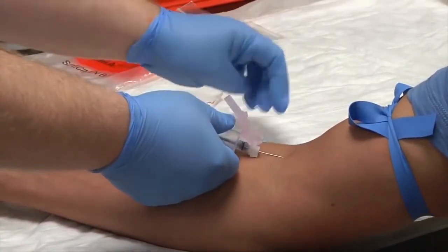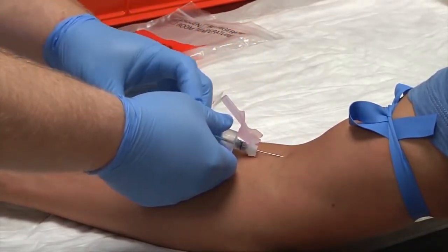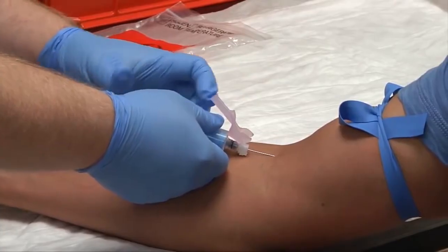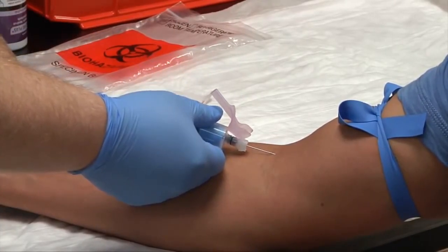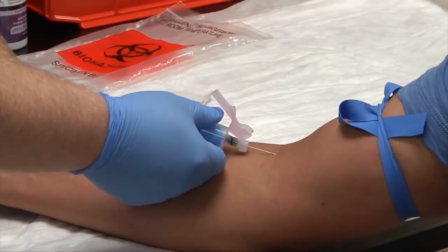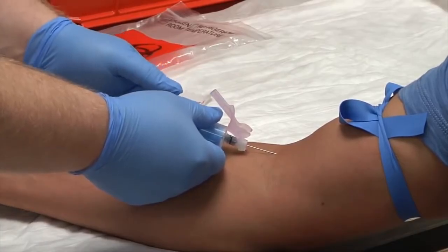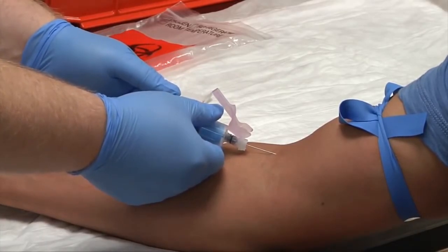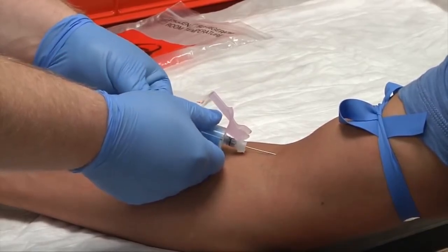All right, so I have my needle in, and with correct order of draw, the light blue tube will go first. We'll let it fill. And this is one of the hard parts, is holding steady with the tube as you're drawing. You still want to have a good hold on the needle. Okay. And remember, always with light blue, you need to let it fill completely. It's pre-vacuumized to stop at a certain amount.